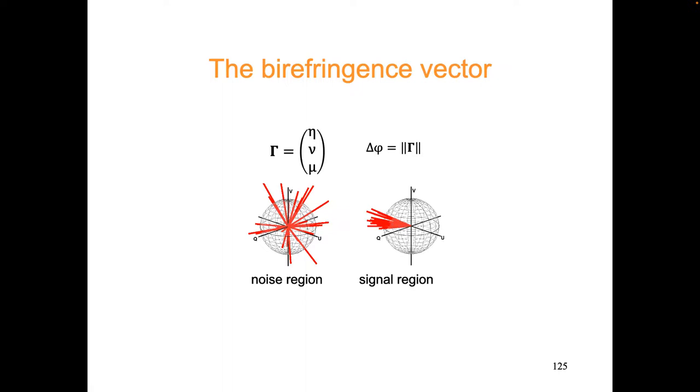The problem is that we always measure noise. So if you just measure it, any material will be birefringent basically with the noise of the signals that you measure. But we can look at a little region. If we measure an optic axis that is basically random over a region, say 50 by 50 microns, versus a measurement where all these vectors are more or less pointing in the same direction, then this is much more likely to be birefringent. So we use these vectors to average out and find regions of signal. We define that as a parameter called optic axis uniformity, which tells you whether it sums up nicely. Uniformity is one when aligned, and completely random is zero.